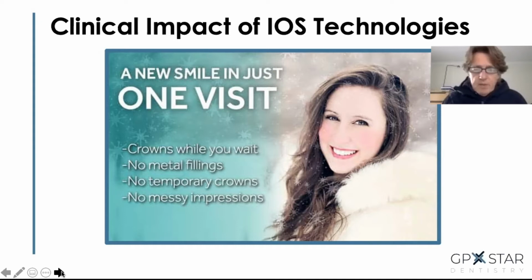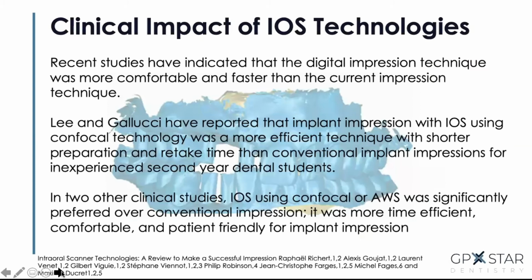You don't have temporaries. And the other thing, and this you will see coming up next, is people are really, really impressed with the fact that you've got a camera and you don't have to put their mouth full of some impression material. Yeah, the gag reflex is seriously reduced. All right, so this is just some reports from the studies that people feel that the digital impressioning technique is way more comfortable for patients than what we're doing currently.